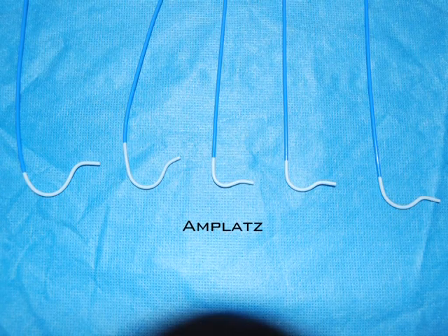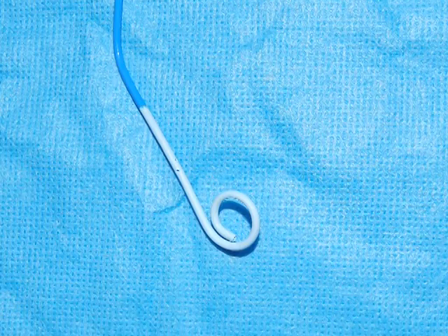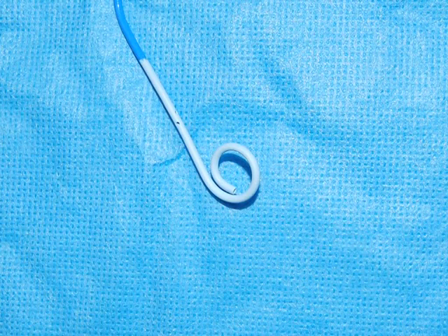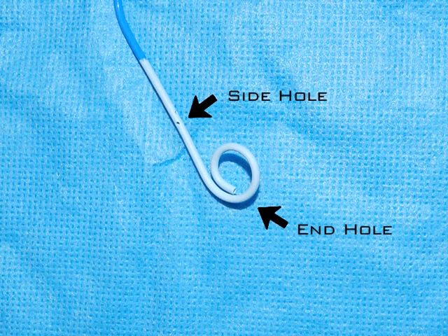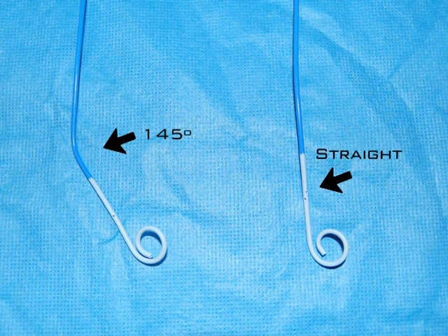For ventriculography catheters, the most common one in use is the pigtail catheter, which has an end hole, the curved pigtail portion, and just proximal to that curved pigtail portion, 6 side holes are punched to permit contrast to exit the catheter through these side holes and a little bit through the end hole so that a cloud of contrast material forms rather than small jets which can irritate the myocardium or even in some cases perforate it. These pigtail catheters can be obtained in either a straight configuration or a 145-degree angled configuration.